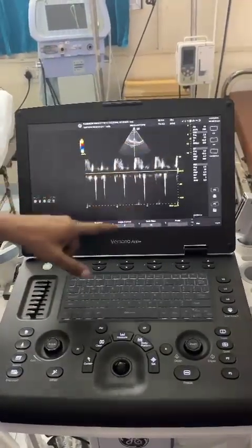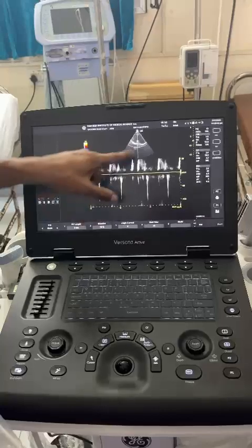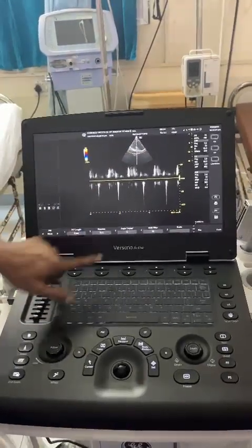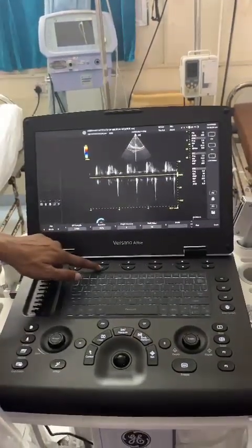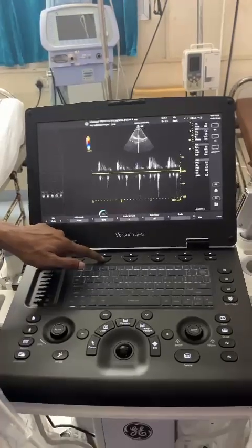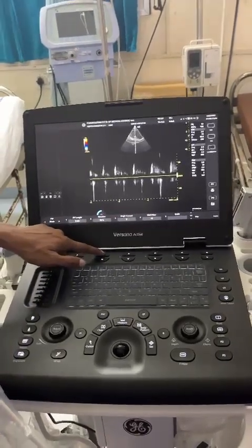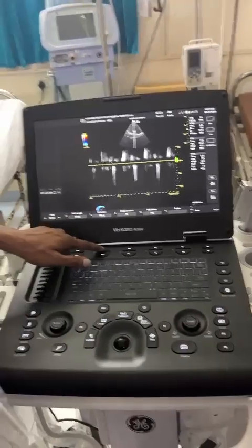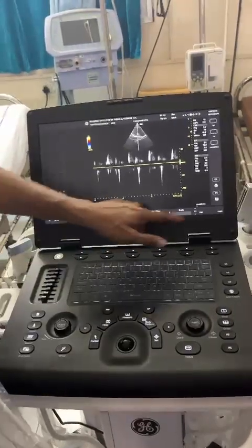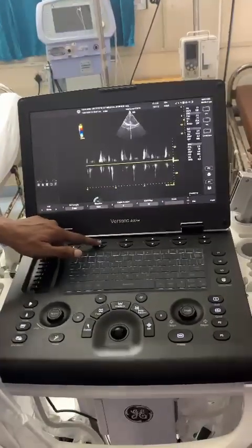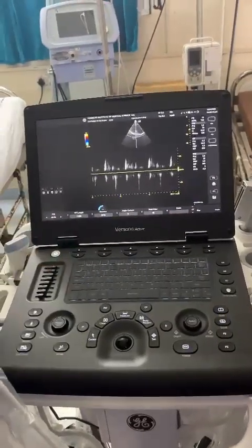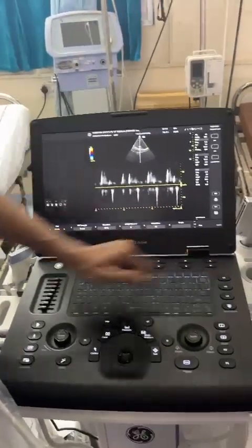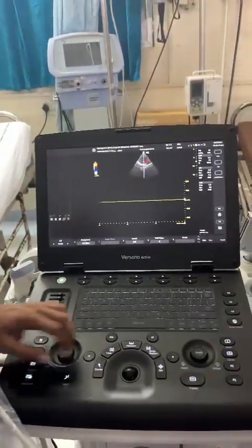Here it is — now it is going for the Nyquist limit. You can adjust the baseline here. If you want to see the graph and if not, you can also decrease the scale. These are PW and these are CW.